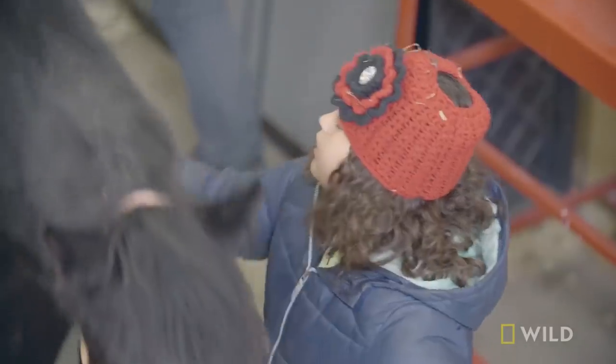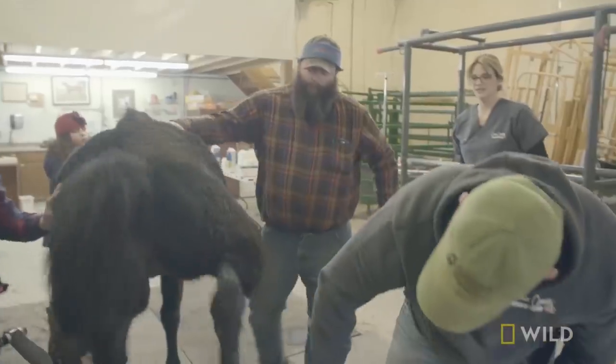Easy, Blue. We're taking off Blue's cast today to see if his severed tendon is healed.